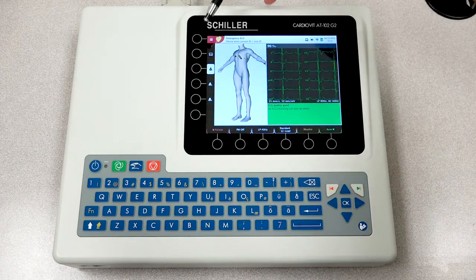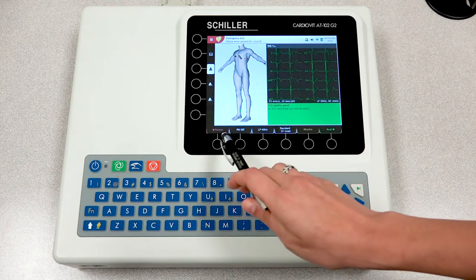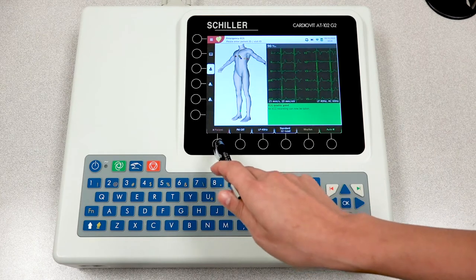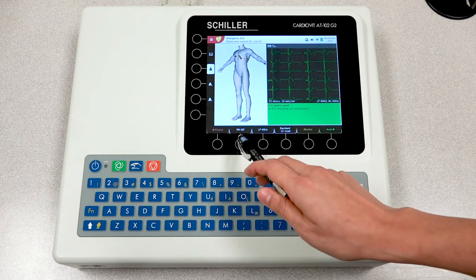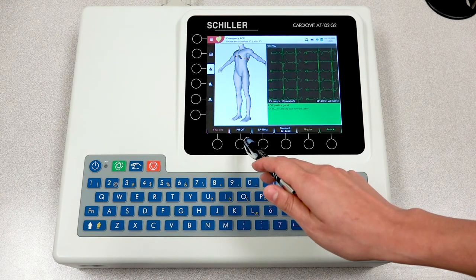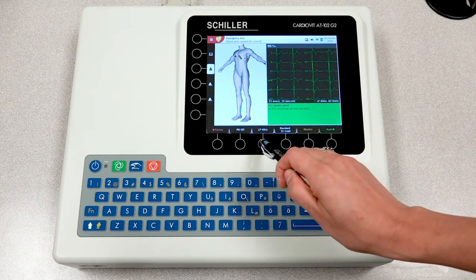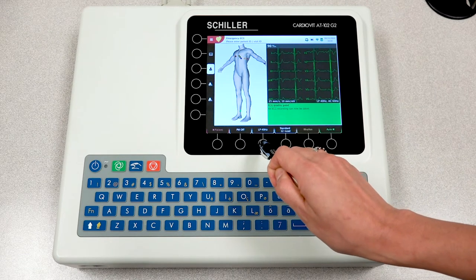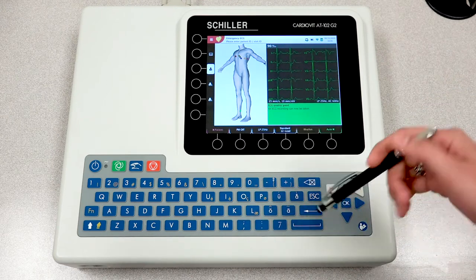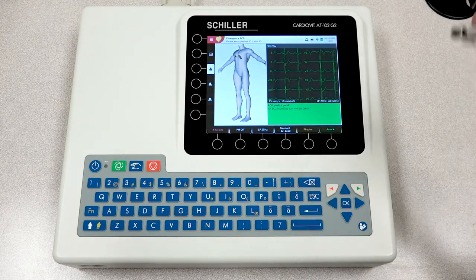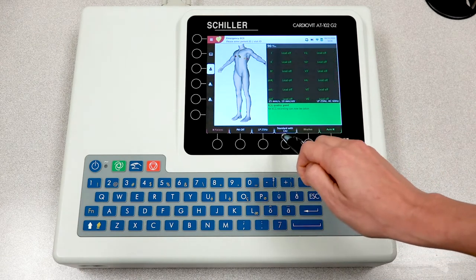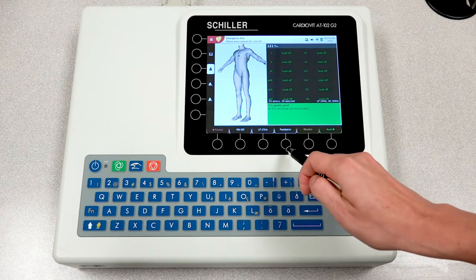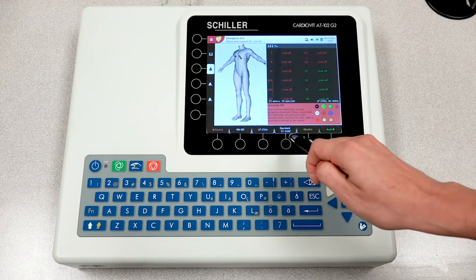Toward the bottom you have a few commands. If you choose to go back into your patient information to correct something, you can do so by pressing here. Here you can indicate whether or not the pacemaker is off, and this will allow you to select the different filters for this report depending on what the doctor would like to see. You also have the option to view different lead placements depending on the preference.